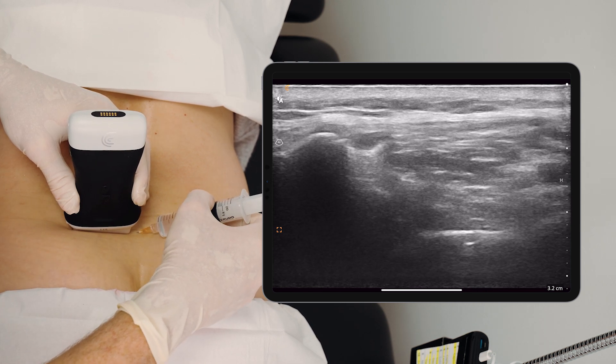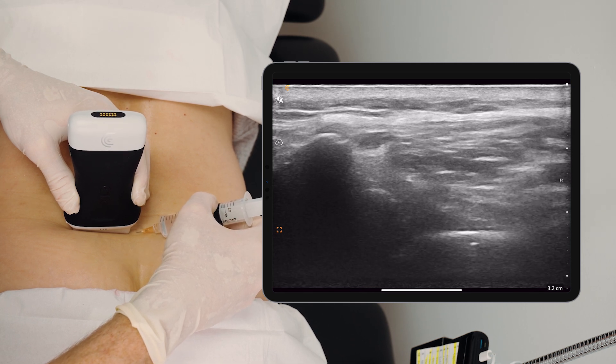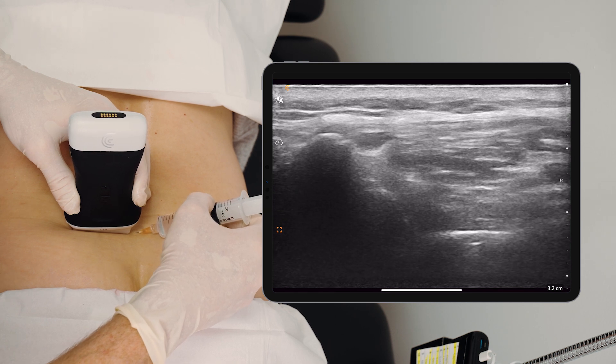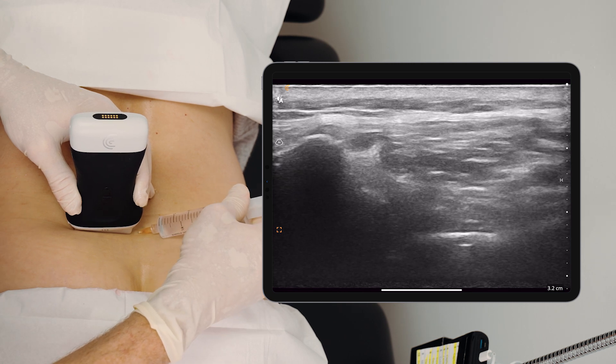And once again, I can't see my needle perfectly. But I can very clearly see that with slight oscillations of the needle, I can very, very clearly see my needle path. And then once the needle touches the ligaments, I can feel that too.